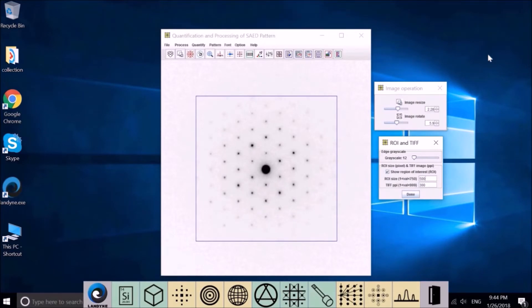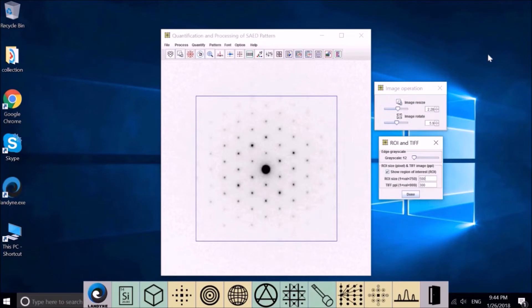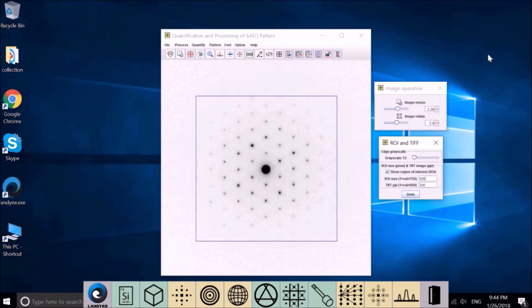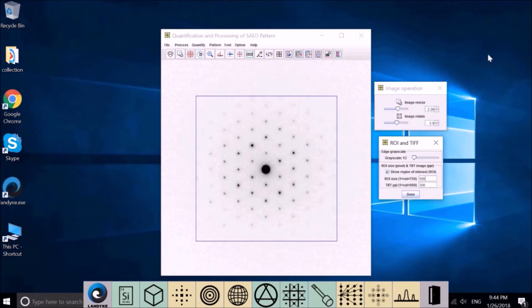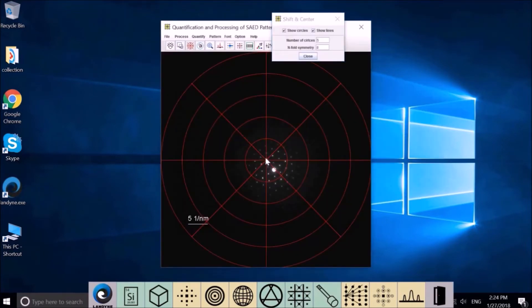Instead of adjusting the brightness and contrast to enhance the patterns, we will remove the background of the pattern and retrieve the intensity of diffraction spots. The intensity of diffraction spots are expressed in the radius of circles. As an option, true symmetry can be restored in the processed electron diffraction pattern.